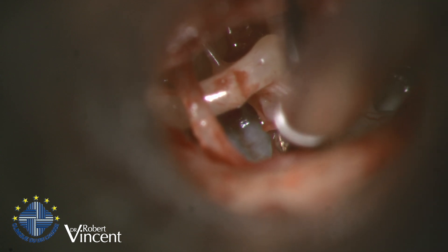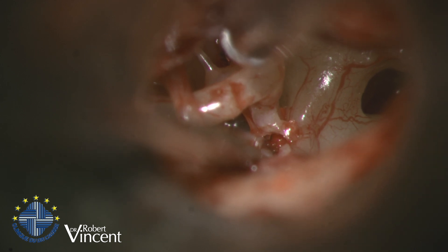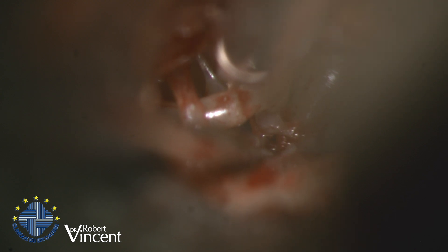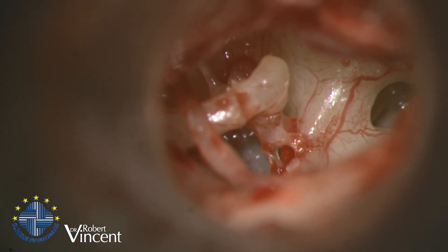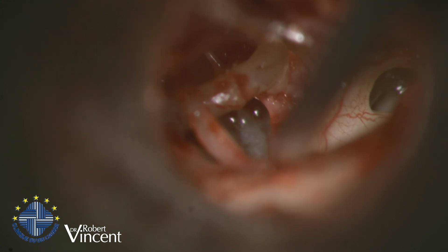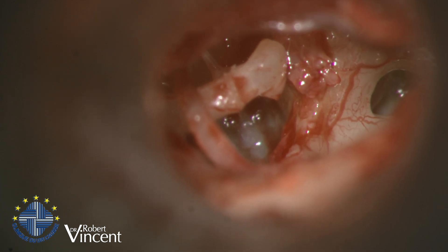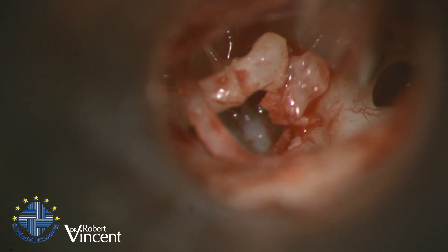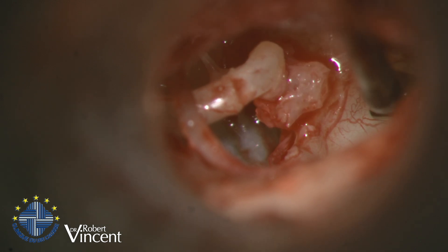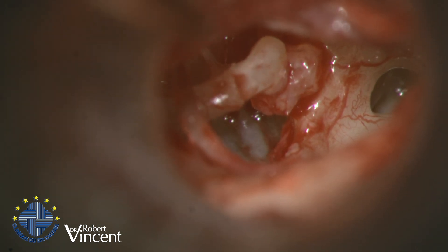The posterior crus is done. Now we need to cut the anterior crus — I will use the suction tube on the other side again. There we go. Now I need to remove the residual superstructure. It's quite a thick stapes head — it's in the last half of the arch.